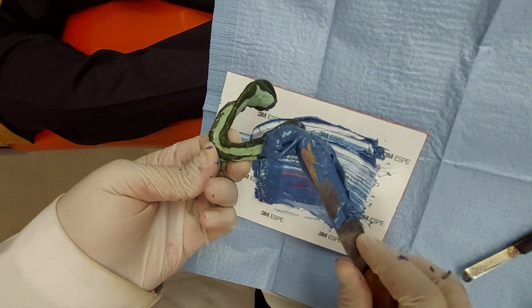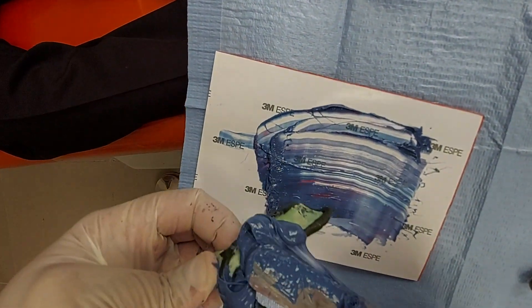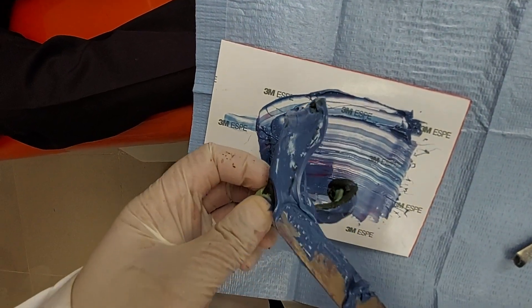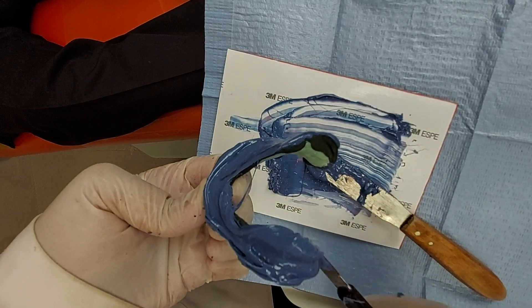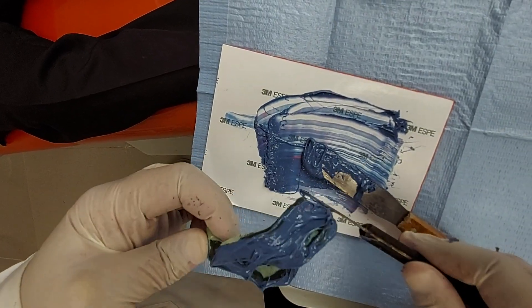After mixing the material, I will take the tray and spread the material all over the tray — on the borders and on the fitting surface. I can use a wax knife to redistribute the material all over the borders as you see.